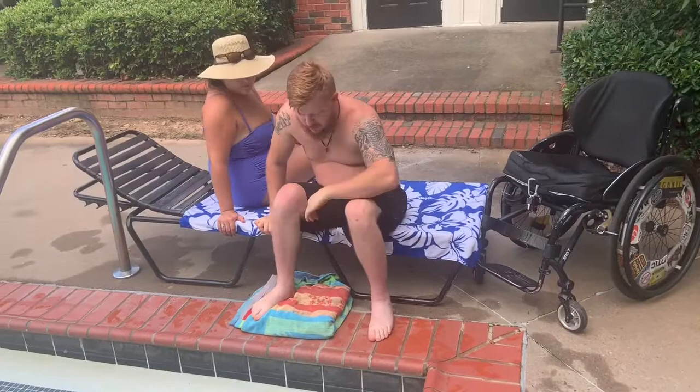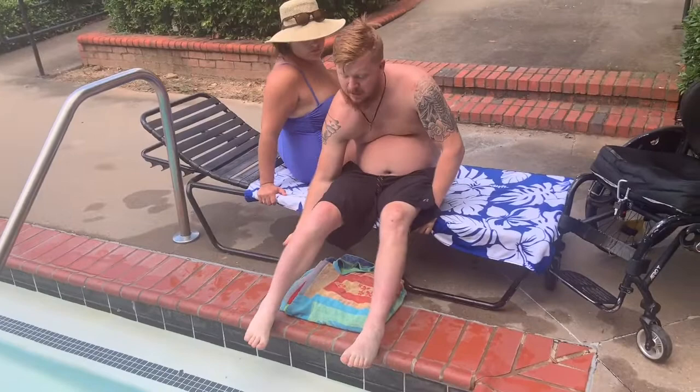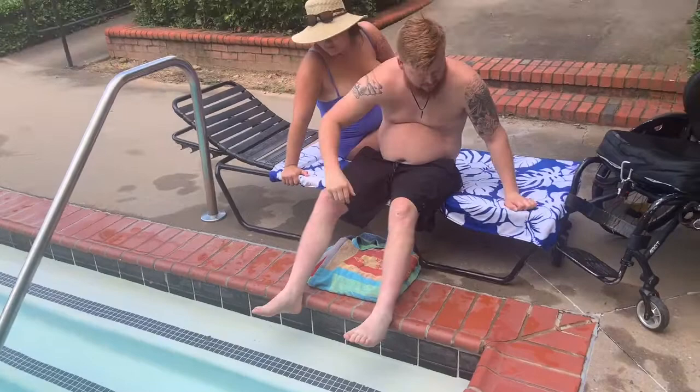I'm gonna scoot over so my butt's right over the cushion towel. I keep my feet kind of out of the way so when I get down there they're not bunching me up and causing spasms. Morgan's sitting here — she's gonna off-weight the chair so it doesn't flip on me. And I just go one knuckle down.